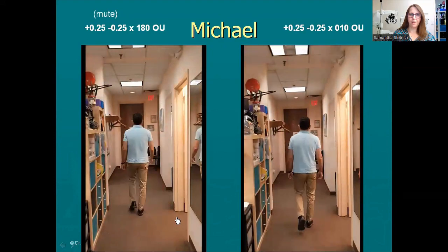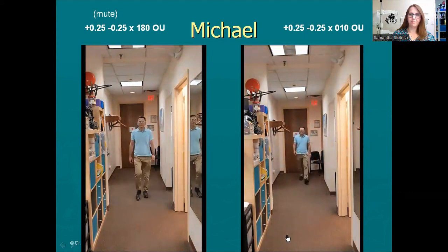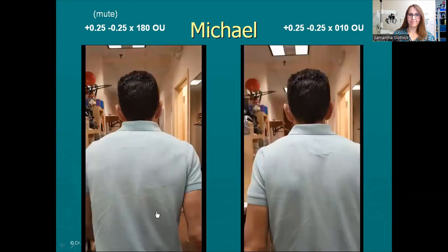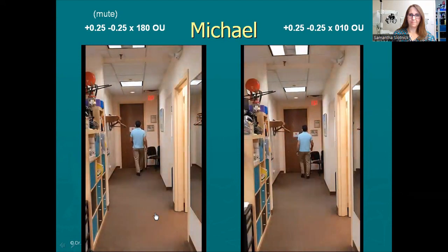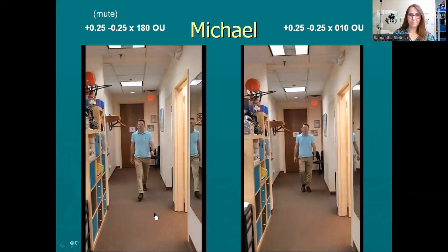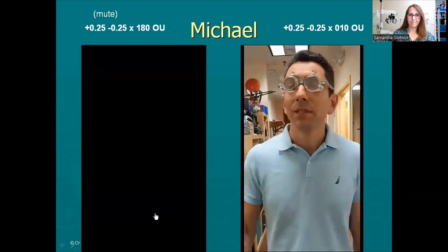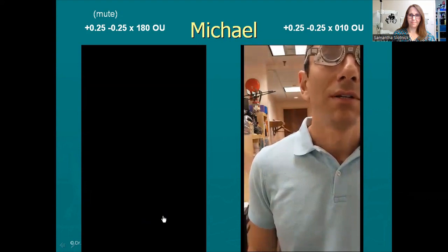If I get them more in lockstep. Oh, head is more upright. And I had said this is more upright. Okay. Do that again. You feel different? I can't tell whether there's any difference. You feel any more energetic? Now that you mention it, I think I do. Because you're walking with more energy. I'm walking faster. I don't know why, but.